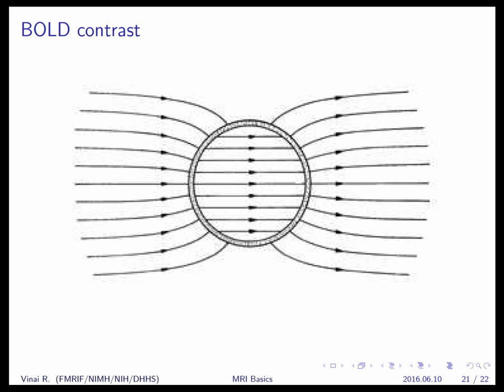Yeah, Andy. So this is a pretty subtle effect. Compared to imaging gradients, this effect is very small. So the rate at which the spins are getting out of phase with one another within the voxel is quite slow with this. It takes a while for them to get completely out of phase. So typically the TE, the time when we acquire the data, in this will be like 30 milliseconds at 3T, to allow the spins time to all get mixed up and jumbled up with respect to each other.